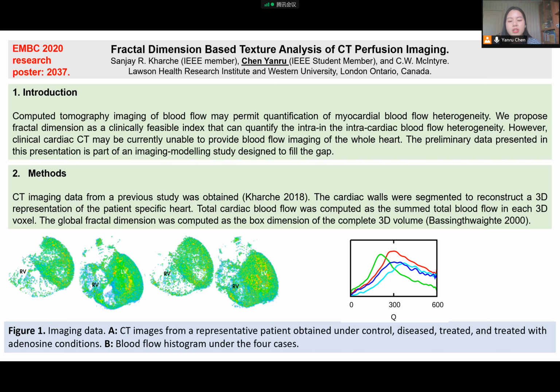The method assumes that coronary blood flow is primarily regulated by the status of the underlying fractal coronary arterial capillary vasculature. It uses the 3D map's probability distribution function and the relative dispersion of the PDF to compute the fractal dimension heterogeneity index. We hypothesize that multi-thresholding provides further information regarding the underlying vasculature.